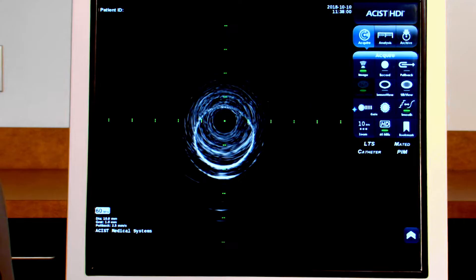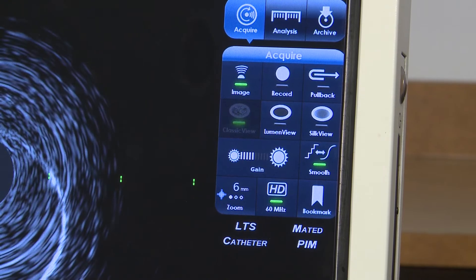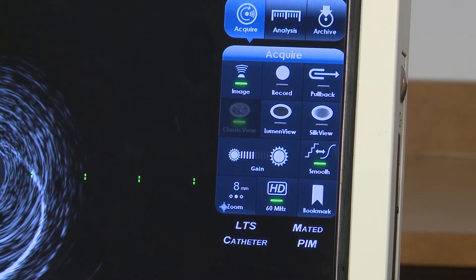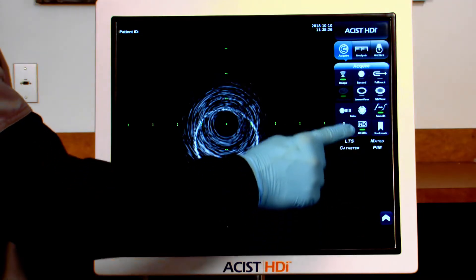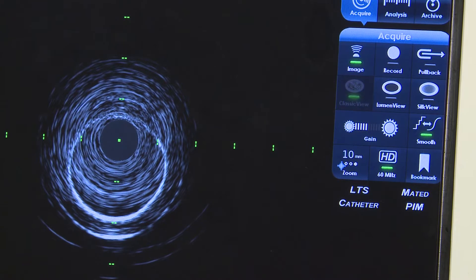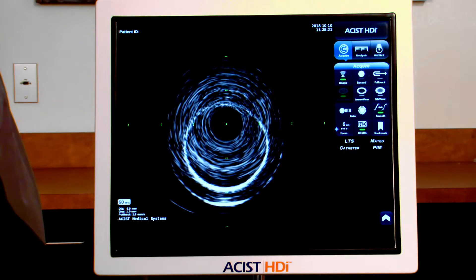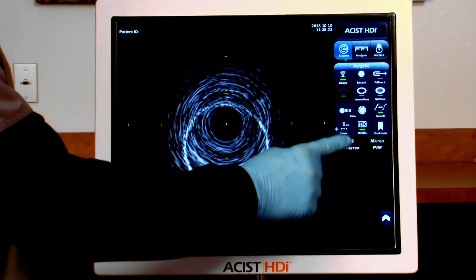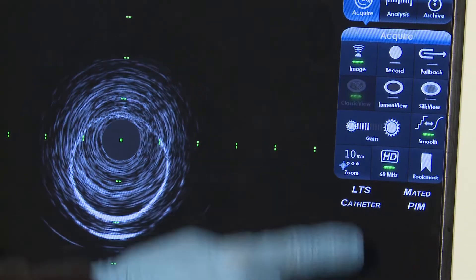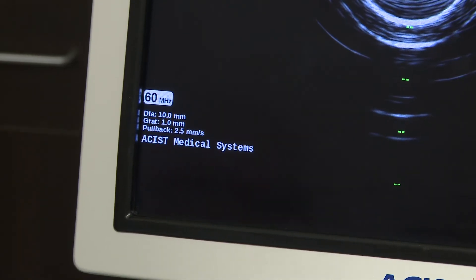The field of view can be adjusted using the zoom function. Adjusting image depth optimizes the display of tissue structures in varying sized arteries. Press the zoom button to scroll through the 10 millimeter, 8 millimeter, and 6 millimeter diameter field of view. The diameter and graticule field of view are displayed on the lower left of the touch screen when imaging.